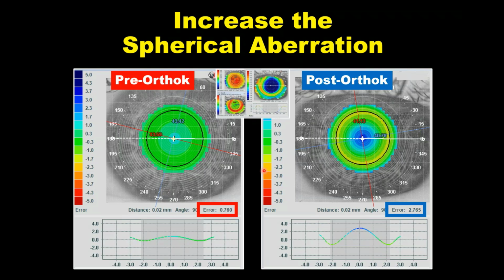If we look at the plus power created along one single meridian, that's really not the understanding 360 degrees around. How much plus are we pushing throughout the pupil? So using the spherical aberration values that the Medmont gives is a more big picture analysis.